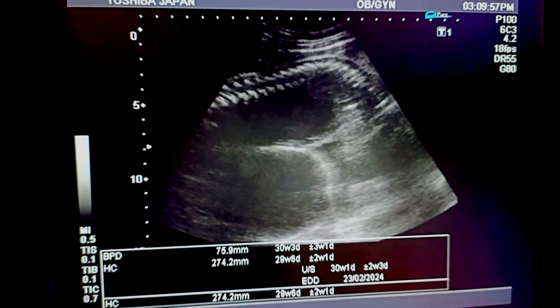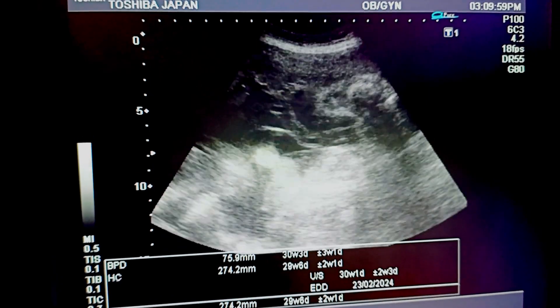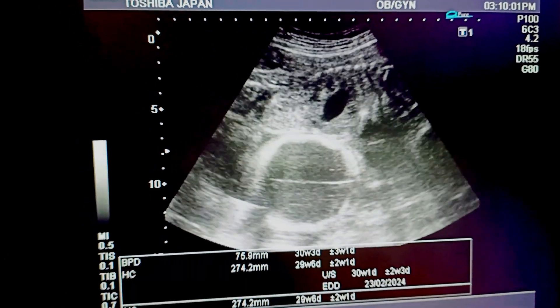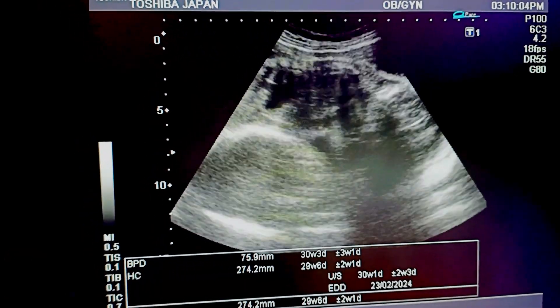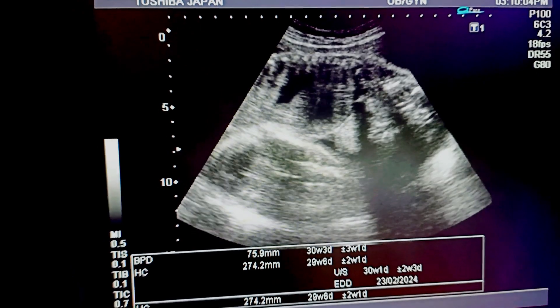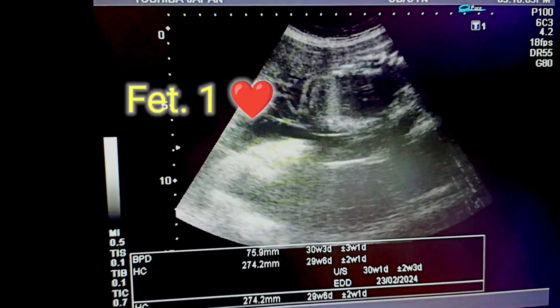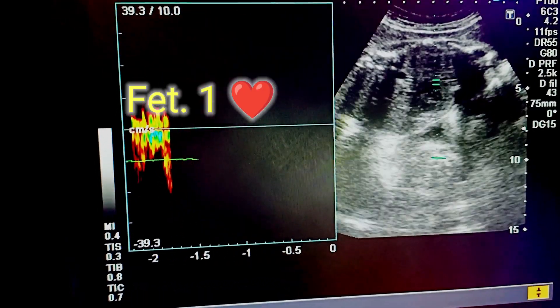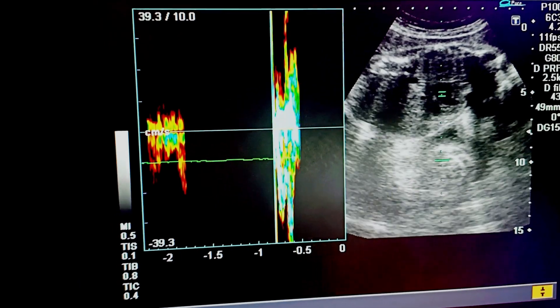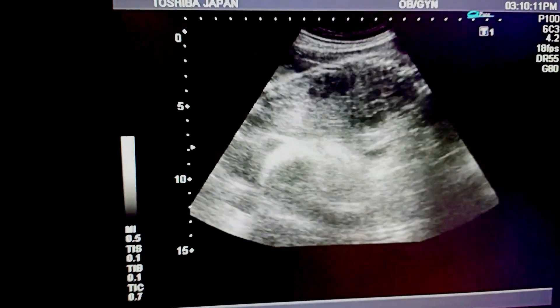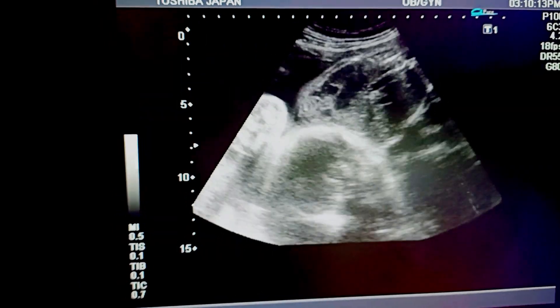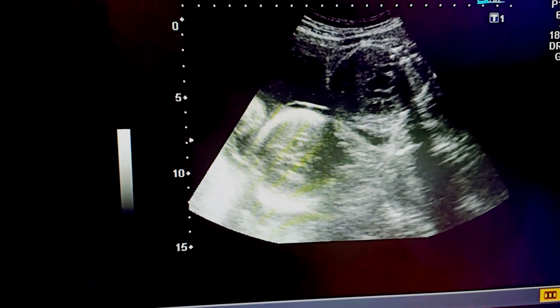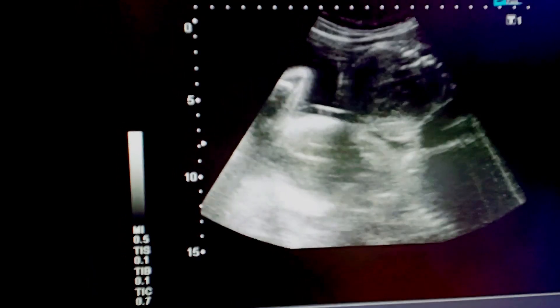Now we calculate the HC and BPD. Moving to the heart, you can see that the heartbeat is present in fetus one. The backbone of fetus one is normal. We would also like to calculate the abdominal circumference at the level of the gastric bubble.